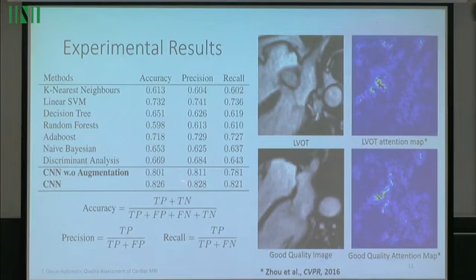One interesting comparison is between with augmentation and without augmentation, which I will try to touch on in the second part of my talk. Here we are using translational and rotational augmentations, so basically translating and rotating these images to enrich our dataset. And this gives us around 83% accuracy.